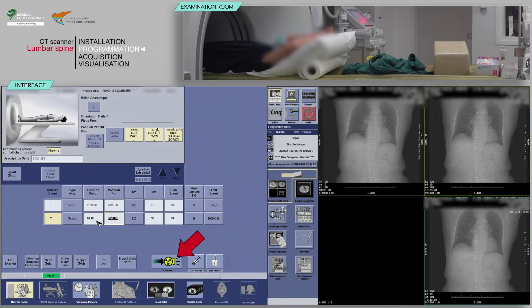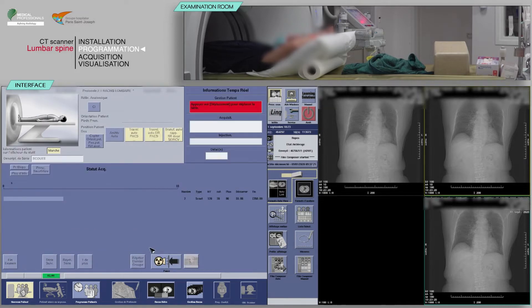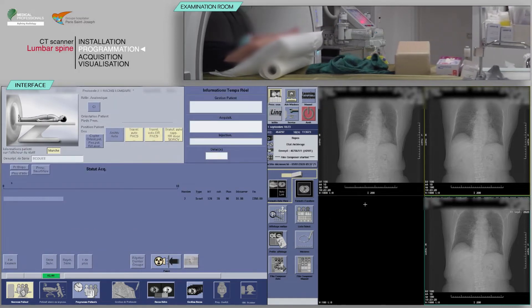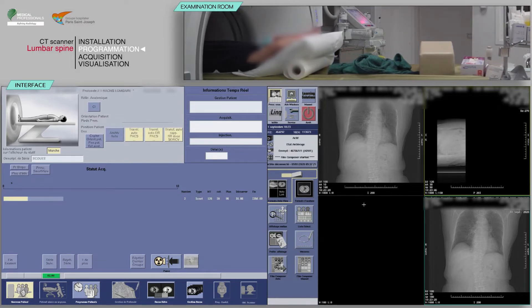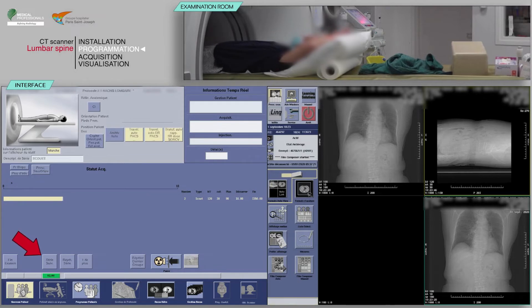You will now need to click Confirm again to obtain the acquisition of the lateral scan mode. On the keyboard, move the table and launch the acquisition when the buttons flash. Click on Next Series.